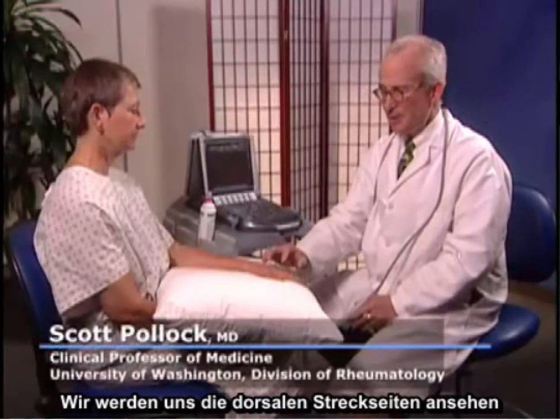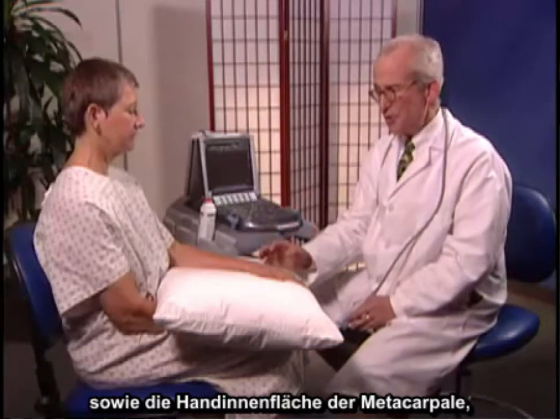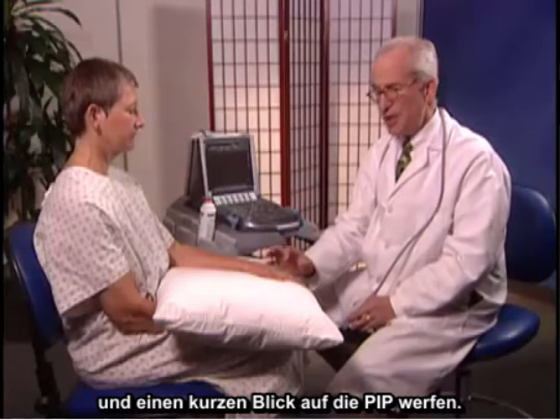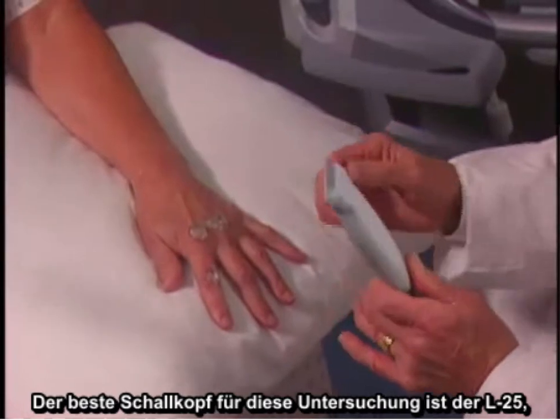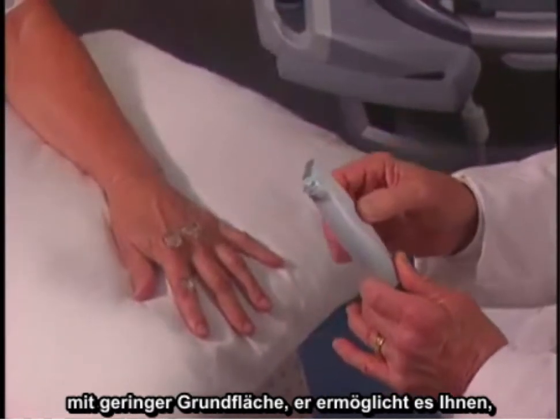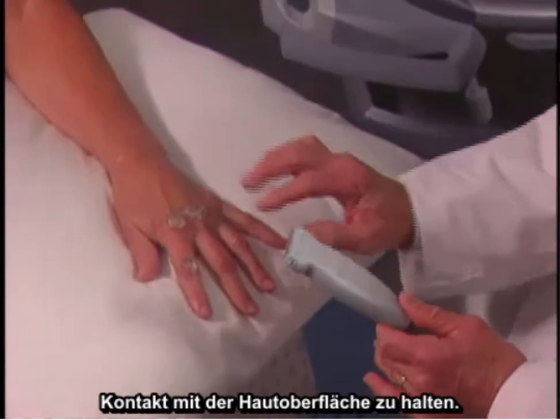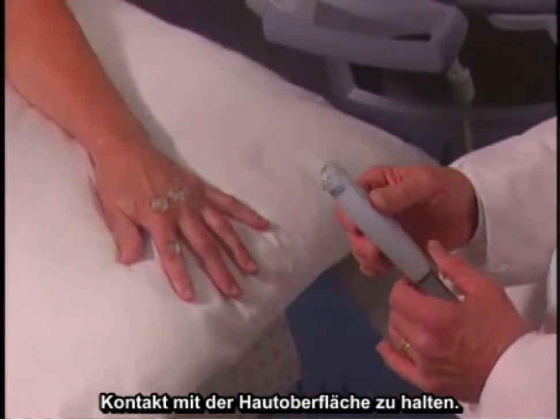I'm going to examine the MCP and PIP joints now. We'll be looking at the dorsal or extensor surfaces, as well as the palmar surface of the MCPs, and just take a brief look at the PIP. The best transducer for this exam is the L25, which has a small footprint and allows you to retain contact with the skin surface.